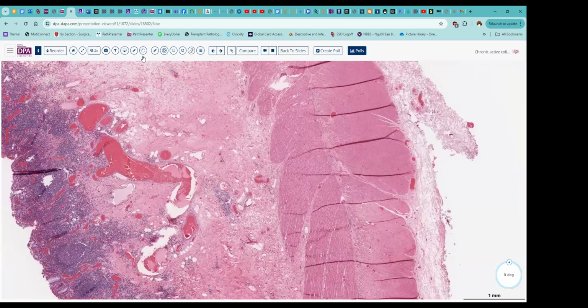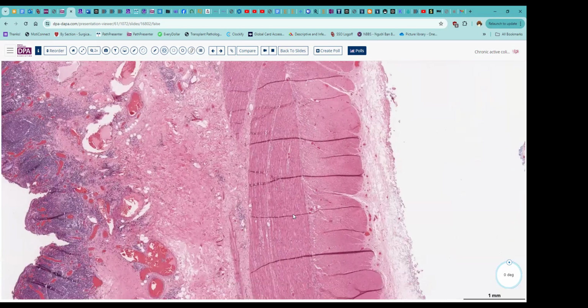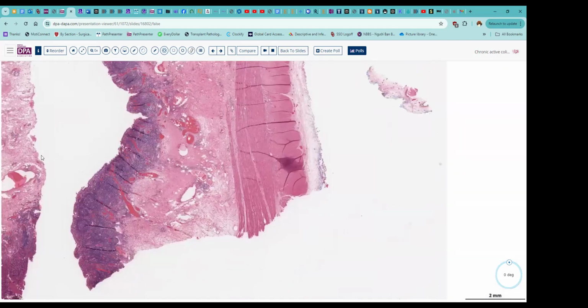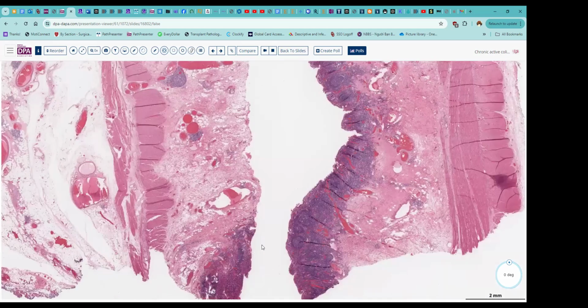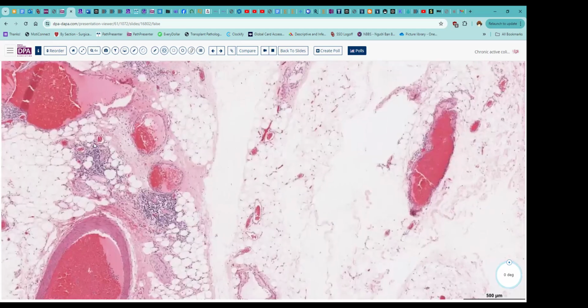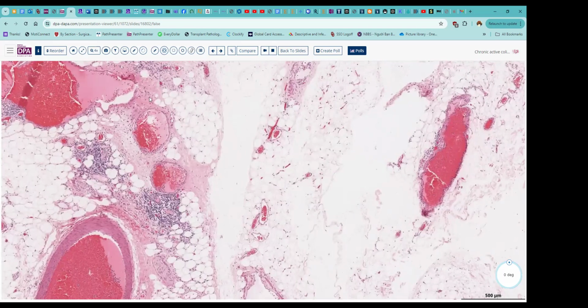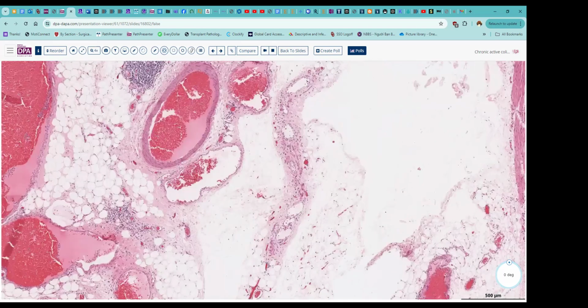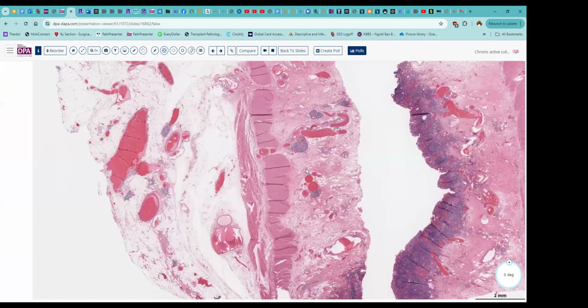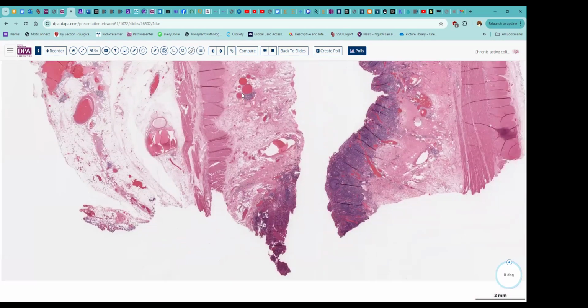We don't see much here in the way of transmural inflammation. So that, again, may suggest ulcerative colitis. Though, again, down here you see there is a little bit that suggests there may have been some antigen leakage and some other things going on down here that may have jazzed this up a little bit.